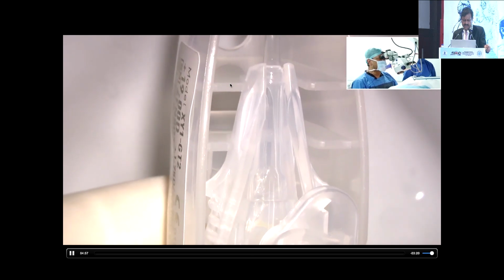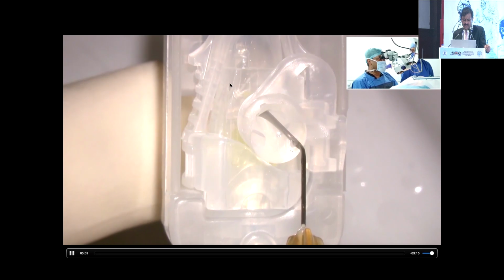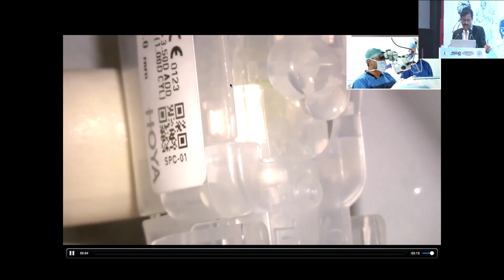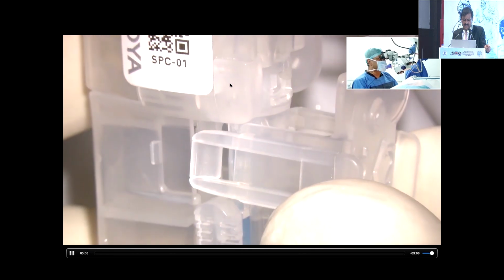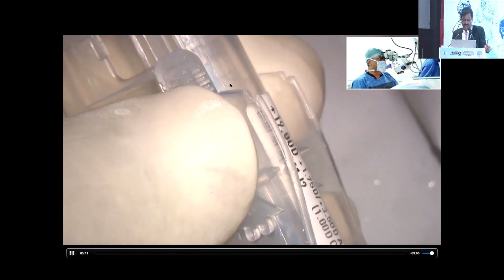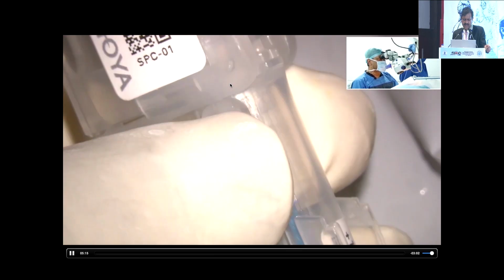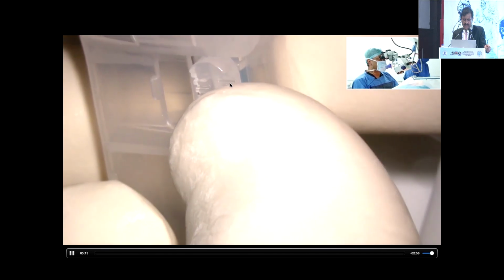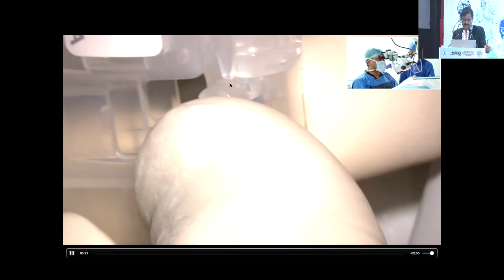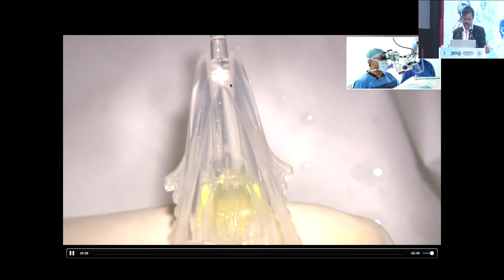Step number 1 is pushing the viscoelastic from this small nozzle here, and this viscoelastic goes and bathes around the implant. The second is holding onto the clip and removing this clip, and the third is forwarding the lens so that it gets folded inside the delivery system. So you gradually remove this from the holder, and the beauty of the system, as has been discussed, is that you can have a shooter as well as a screw kind of injector.